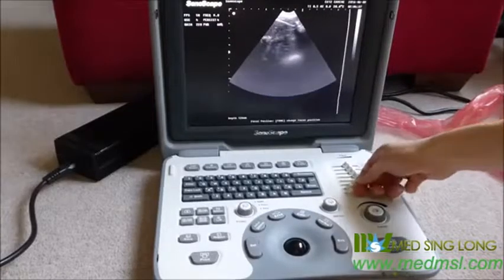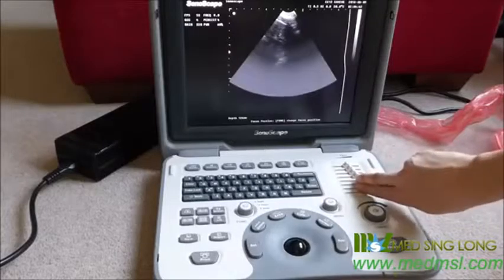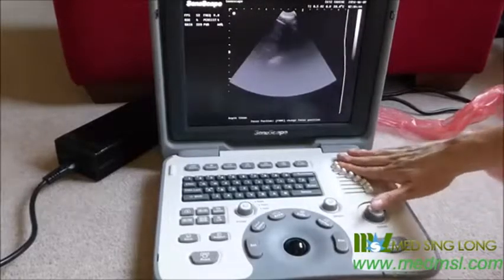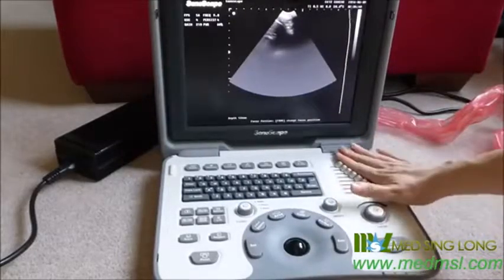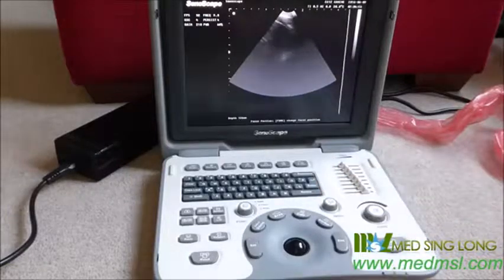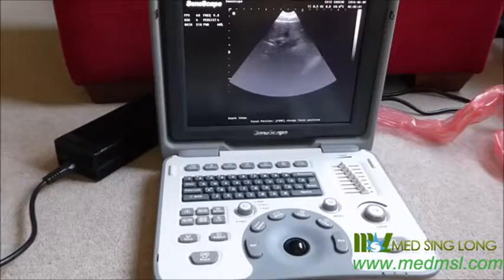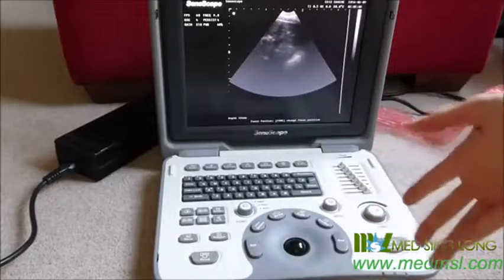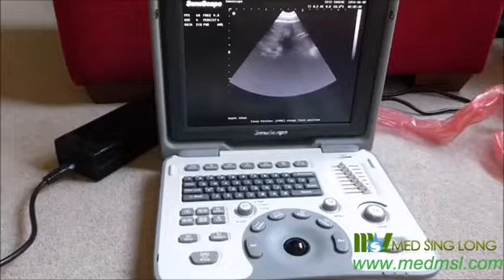So if I bring it down here, do you see how at the bottom it's got darker? Now it's brighter. At the top, darker, brighter. So either just have it as a slope like that, or some people like to keep them kind of in the middle. Again, that's something you should learn to play around with, but perhaps to start with, have them just a slope like that, or all in a line to begin with, because the machine will compensate when they're in a line anyway. I hope that helps and isn't too confusing.